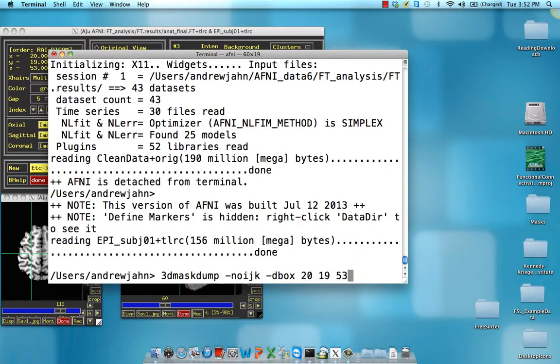Make sure that these coordinates are what you jump to with the x, y, z. They're not always going to be the same thing you see in the upper-left pane of the AFNI viewer. That's something, it's a topic for another discussion, but just be aware of that.